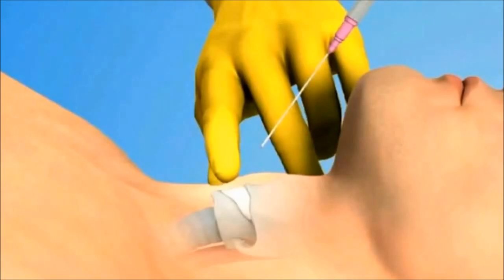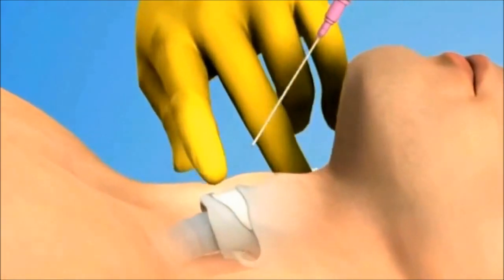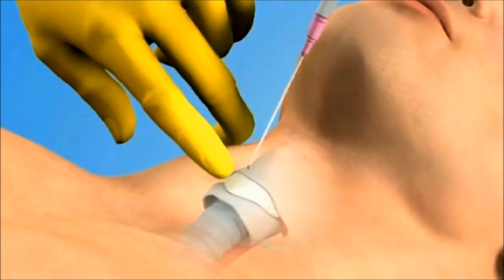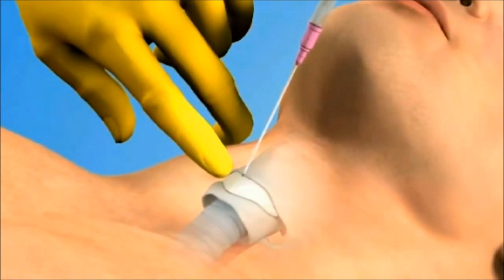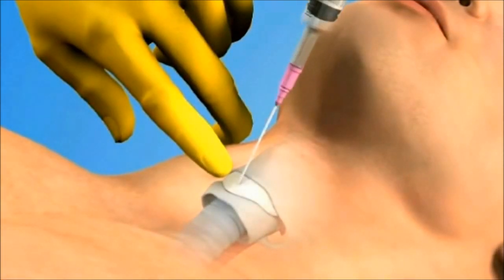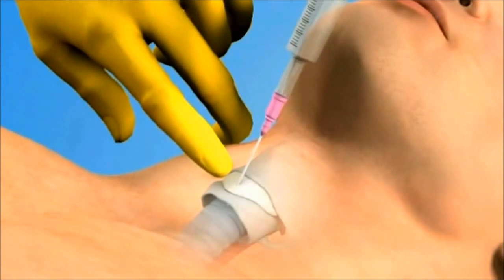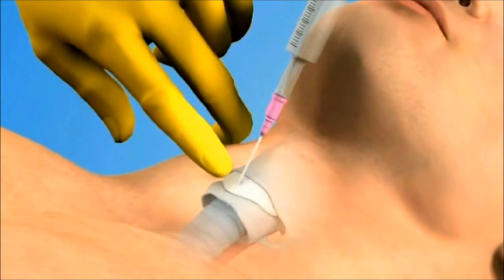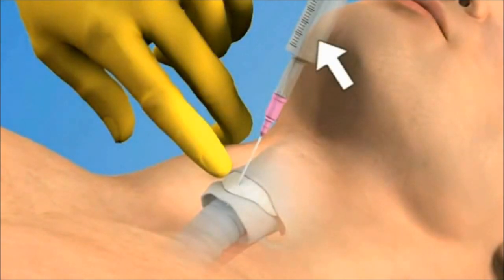Direct the over-the-needle catheter and syringe assembly in a caudal fashion and pierce the cricothyroid membrane at an angle 45 degrees relative to the skin surface. Pull back on the plunger during advancement. Entrance into the trachea will be heralded by a return of air into the syringe.